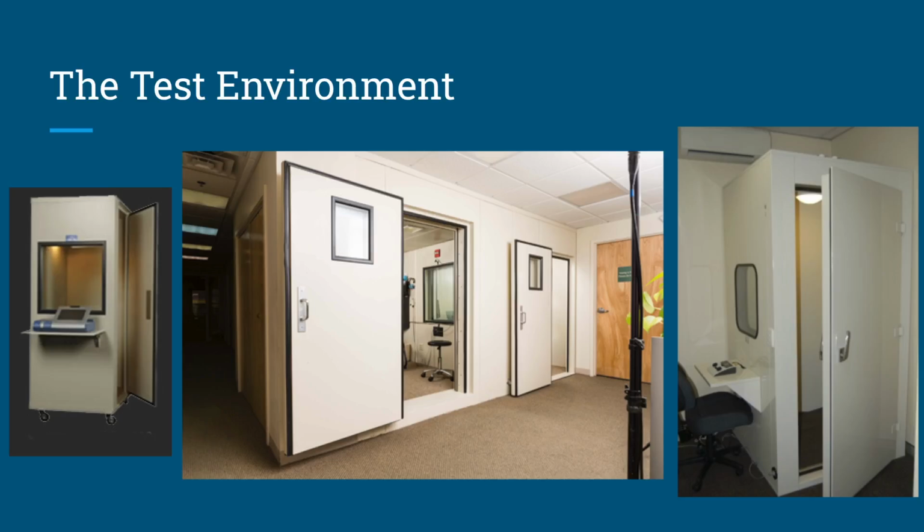So it's becoming a little bit more common not to use a test booth, but it's still the norm in general. If you work in an ENT clinic, you're going to be testing with a sound-treated booth. If you work in a speech and hearing clinic at a university, you're going to be testing in a sound-treated booth. If you work inside a VA, you're going to be using a sound-treated booth.